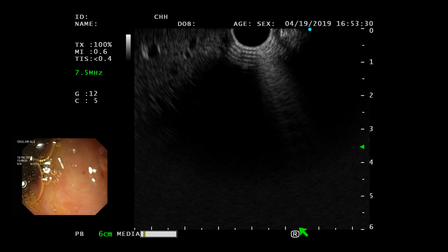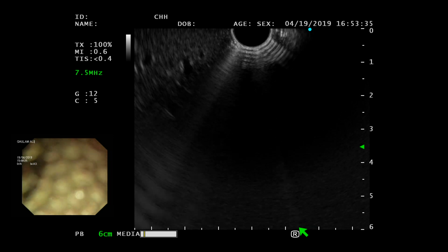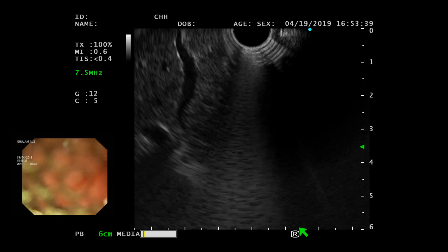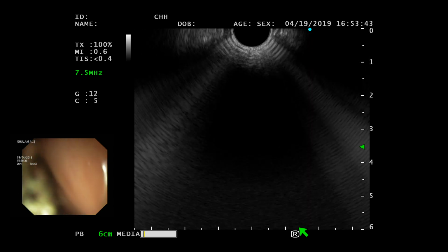Okay. And sometimes it happens there is not much space actually in the duodenal bulb, क्योंकि edema की वजह से. देखे ना कि बिल्कुल स्पेस नहीं है वहाँ पे. आपको तो ये भी नहीं रियली पता लग रहा कि वो एक्चुअली ल्यूमन है कहाँ पे, ठीक है? तो सो मच edema पे, ठीक है?